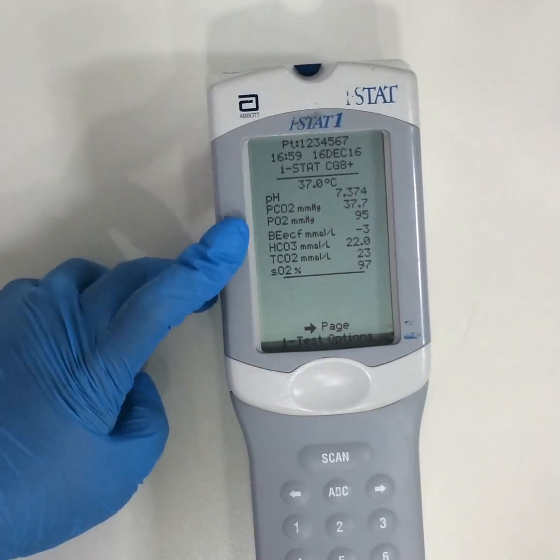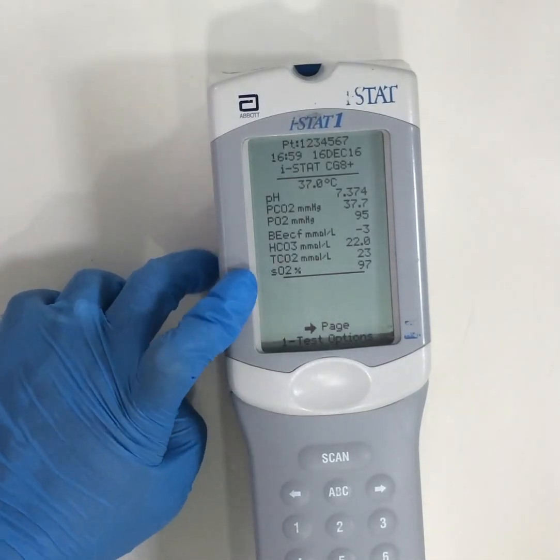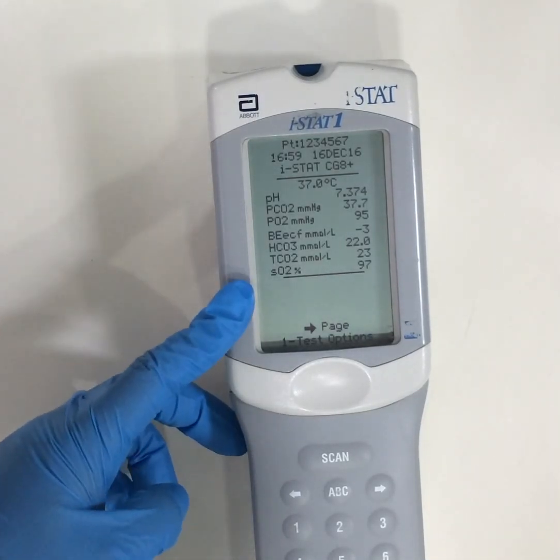The parameters which are measured are pH, pCO2, O2, base excess, HCO3, and oxygen saturation.